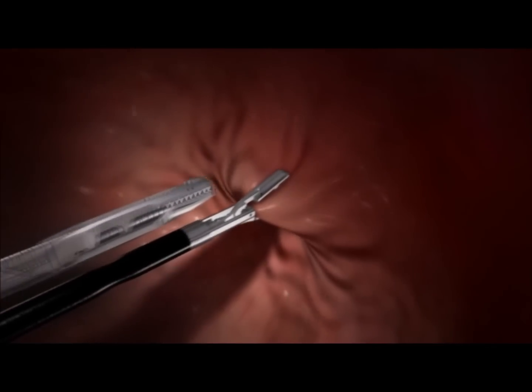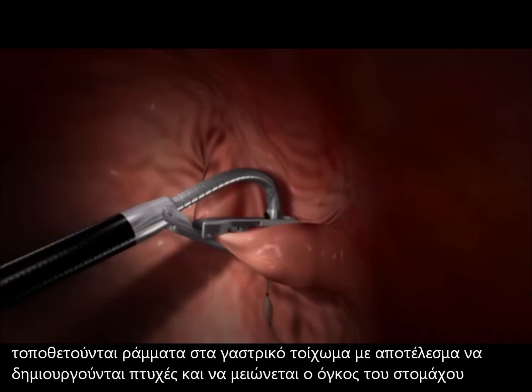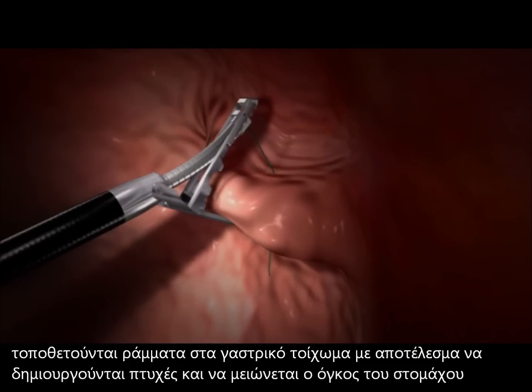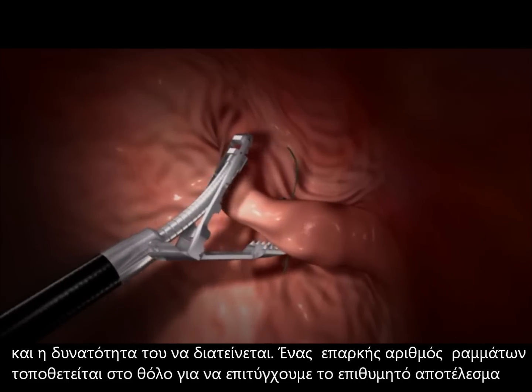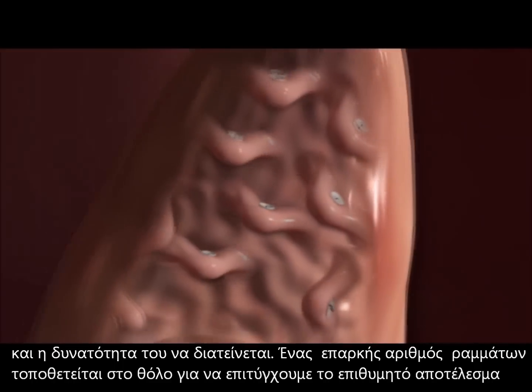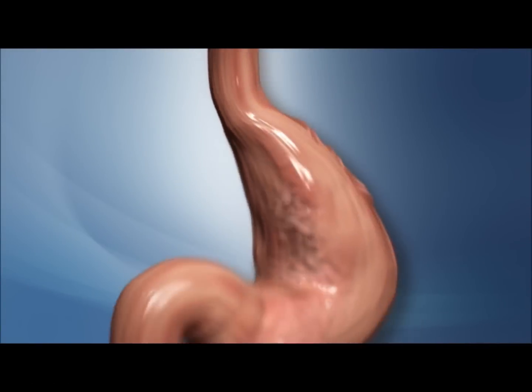The tools then grasp tissue and place anchors into the stomach wall. By gathering tissue into folds and anchoring it, the surgeon reduces the capacity of the stomach and its ability to expand. A sufficient number of anchors is placed in the fundus to achieve the desired result.